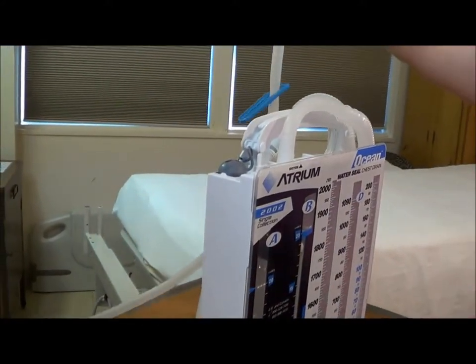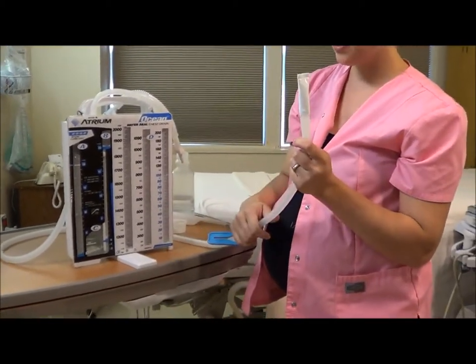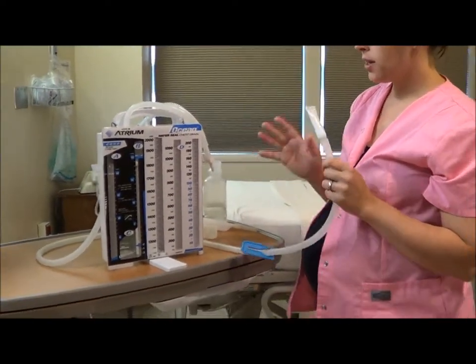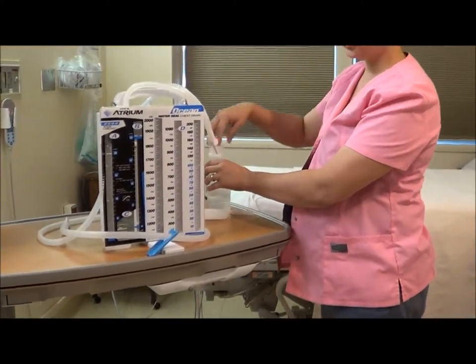That's all you need to do to set up the chamber. If you are assisting with insertion, leave this white cap on — that keeps the end sterile. This is the end that will go to the patient, to the chest tube. The other thing you may need to know for setup right away is how to hook it up to suction.